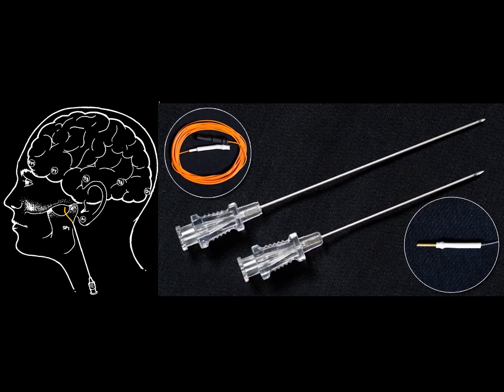I doubt very much that you would ever use a sphenoidal EEG electrode, so I will not explain its insertion. In the past, I have placed a few of them. Overall, I think patients tolerate having the procedure done better than I tolerate doing it, but still, not much was ever gained from doing them.